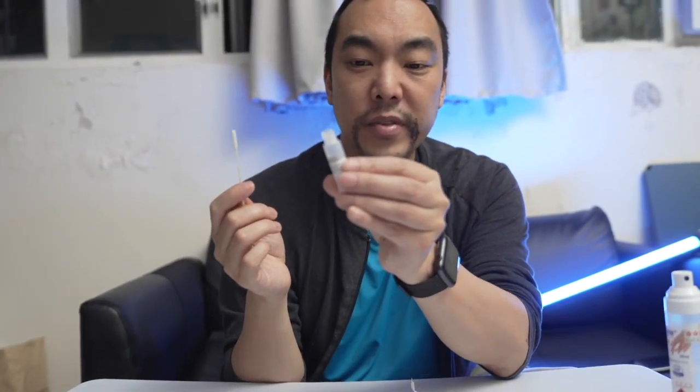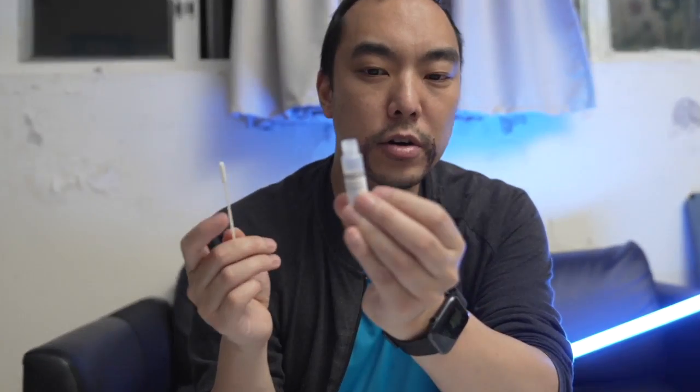Enough of that. Alright, enough? You do need to go deeper. Doesn't go deeper. Okay, that's enough. Okay, enough? Right, now I'm going to put it into the extraction buffer.